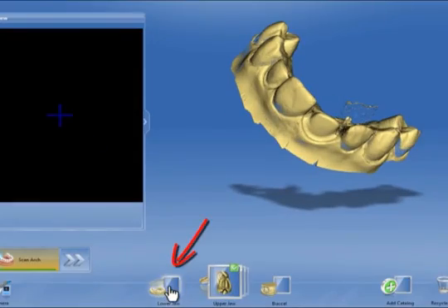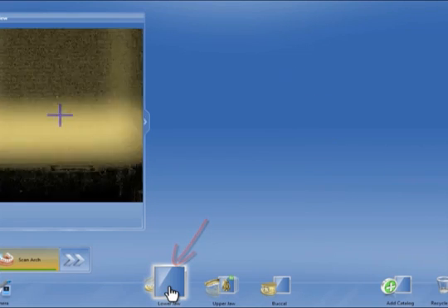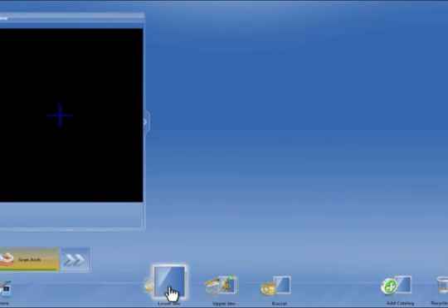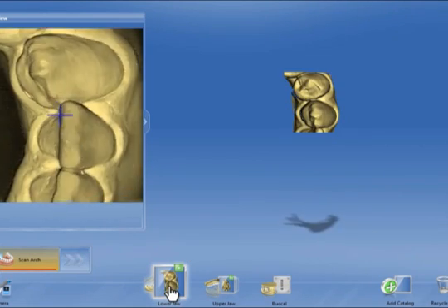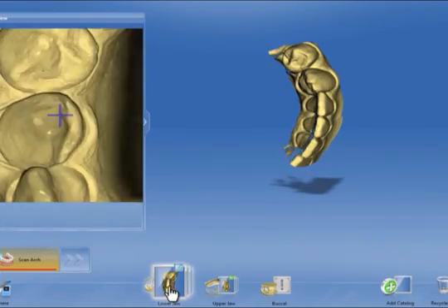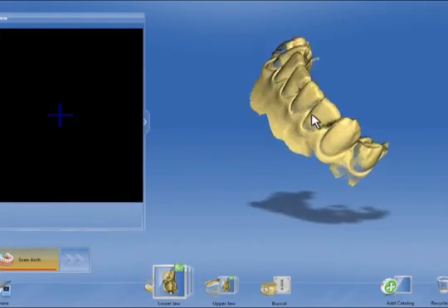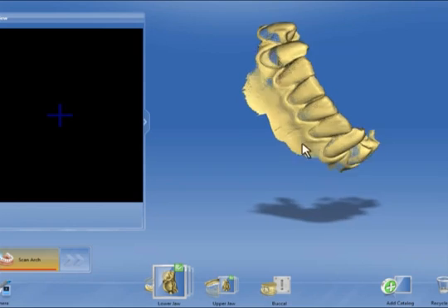Change now to the lower jaw catalogue. Scan the lower jaw from premolar to premolar, this time taking care to clearly capture the incisal edge.